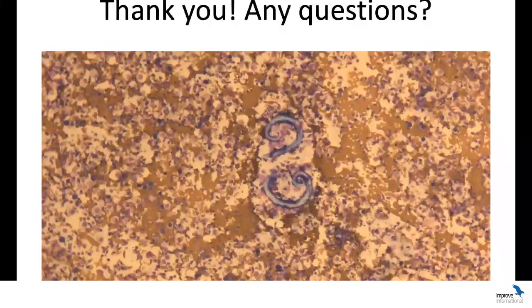Awesome. Okay, so we have got one question. It's, on occasion, when sampling masses by FNA, I get quite a bit of blood contamination. Does this matter when evaluating cytology, and is the smear then useless? So it matters when evaluating cytology, but the smear will not be useless. It will just be more difficult to evaluate, especially if there's lots of neutrophils in your peripheral blood.